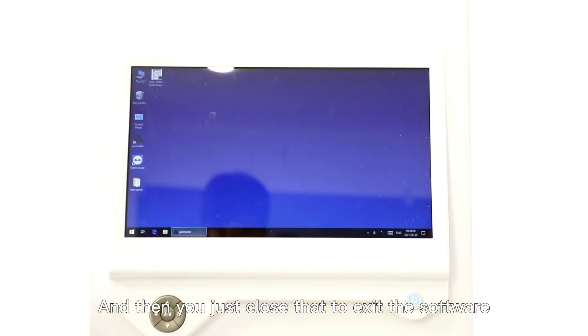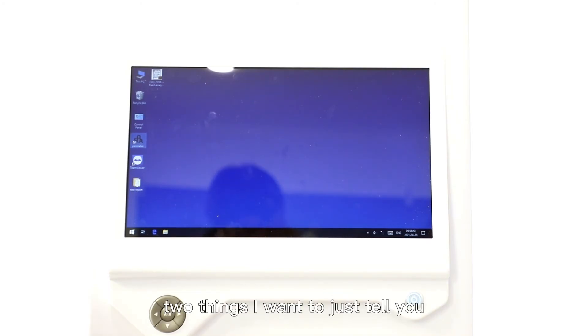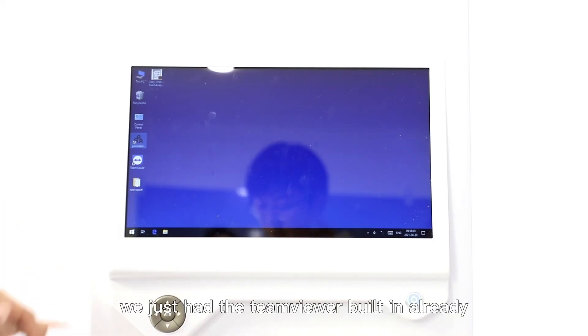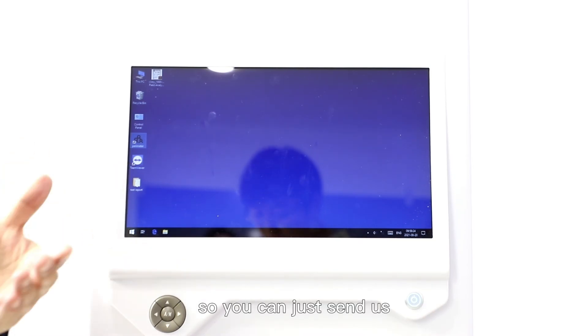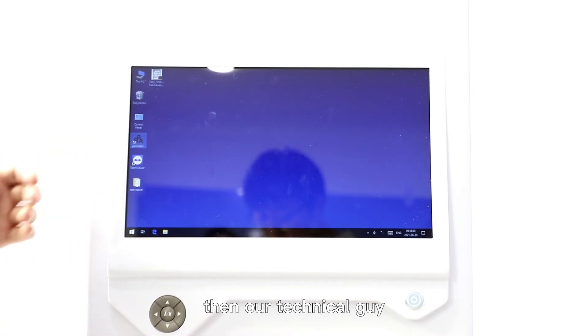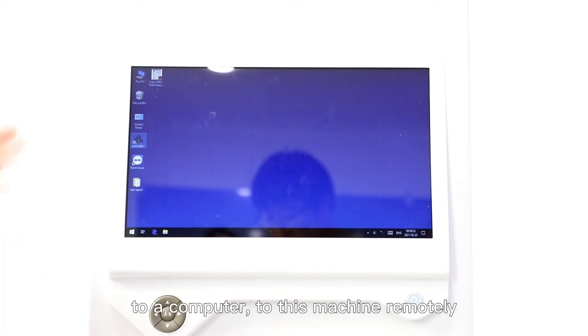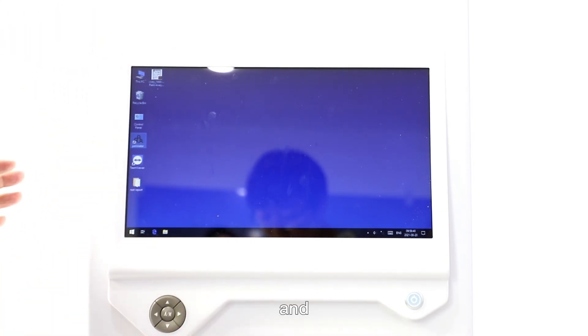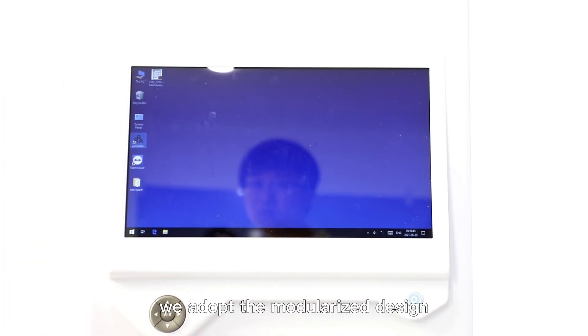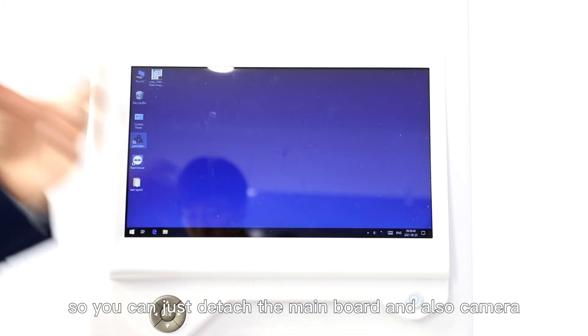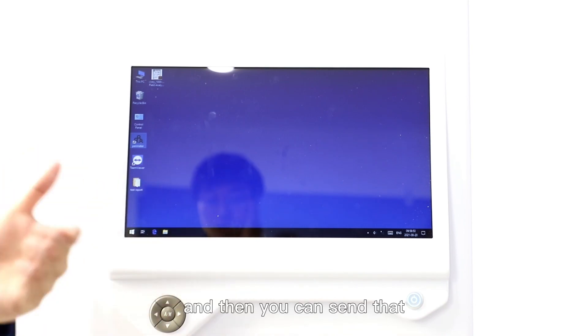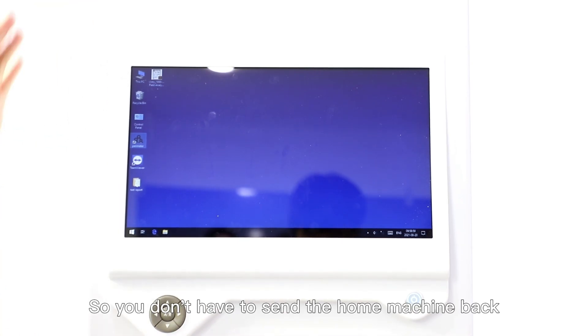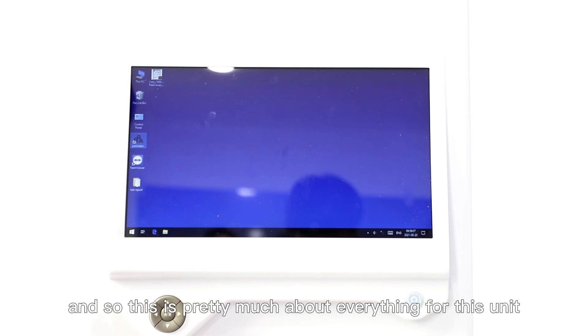There are two other things I want to tell you about after-sales service. For software issues, if anything goes wrong, we have TeamViewer built in already. You can connect the unit to the internet and send us the password, then our technical team can access your computer remotely and fix the issues. For hardware issues, this unit adopts a modularized design, so any parts can be detached separately. You can detach the main board, camera, etc., and send that back to us. We'll get it repaired and send it back to you, so you don't have to send the whole machine back. This facilitates everything for the after-sales service. This is pretty much everything for this unit.